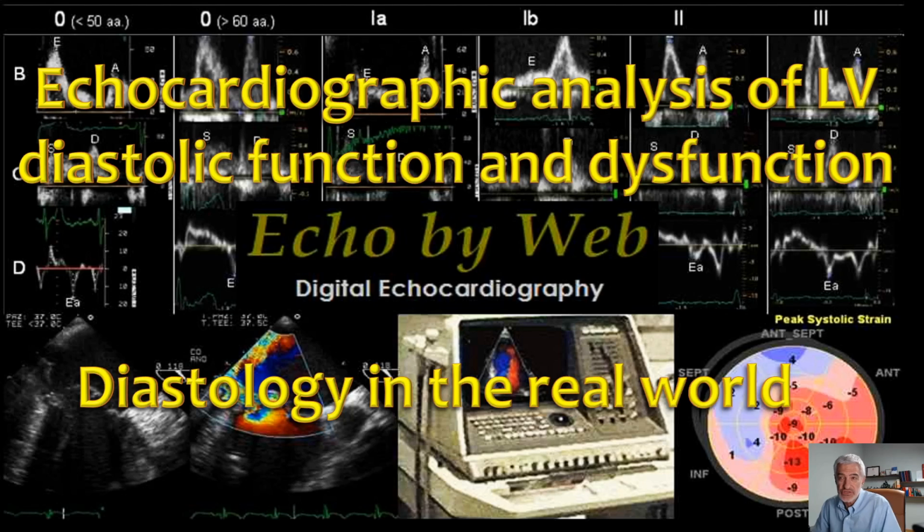Now, these talks assume that you have a basic understanding of how to perform pulse Doppler and continuous wave Doppler interrogation of intracardiac flow, and also how to use tissue Doppler, myocardial tissue Doppler. It is also assumed that you know how to perform basic echocardiographic measurements. However, you will find on the website echobyweb.com, which I've just mentioned, a large quantity of educational materials to address these topics.